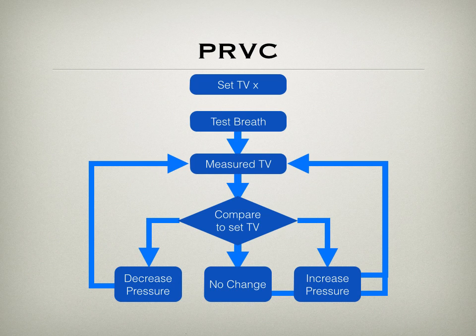That is good for patients because when the patient is awake and strong enough to work on his or her breathing, she can get the least amount of support while guaranteeing she gets the same tidal volume. But if the patient is getting tired, getting some sedation, or having a procedure, and is unable to participate in breathing so much, the machine will increase the level of support to give the set tidal volume as well. So you don't have to keep readjusting it.